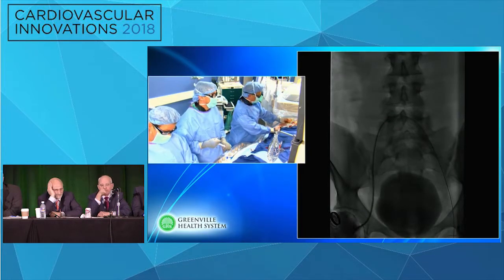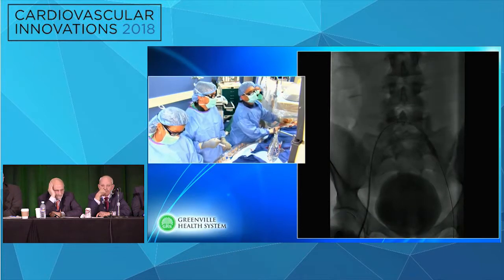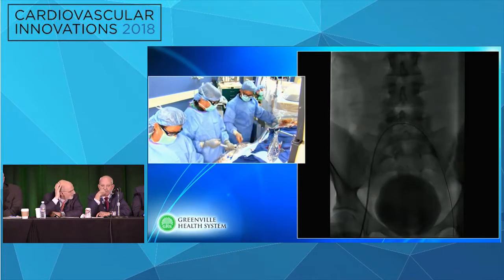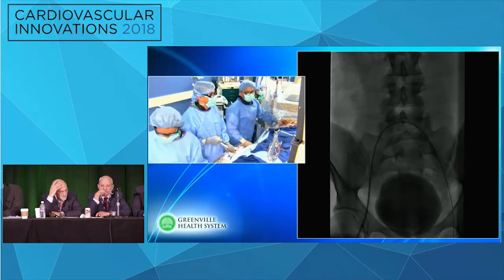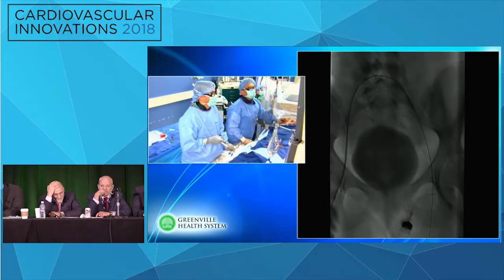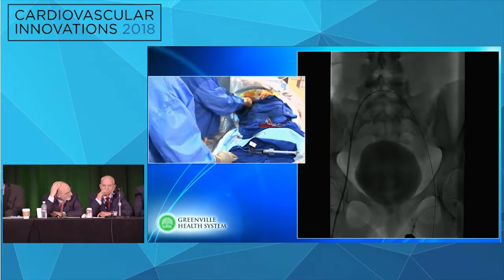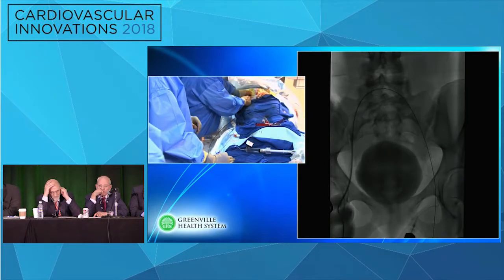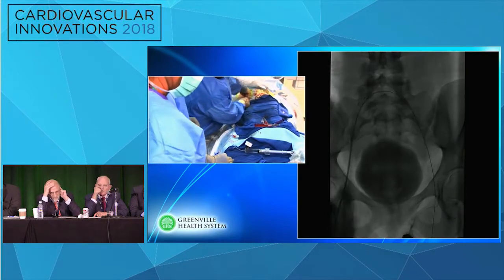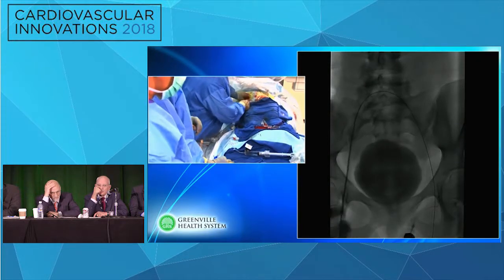Of course, I would agree with Kenny that I would just go up into the IVC and stent it backwards. Yep. You will cross the right. Yes, I will cross it. I don't think that'll represent a problem. Yeah, I don't think you're going to have a choice but to cross the right. Otherwise, you're not going to cover the inciting lesion that caused all this problem in the first place. You have to make sure that you cover the lesion. So you have to, by definition, extend it into the IVC.